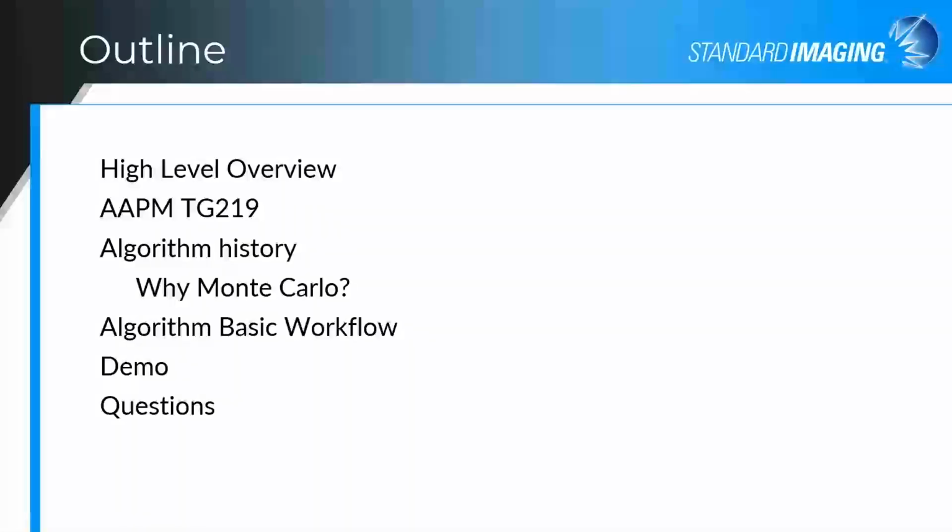So here's an outline of my presentation. I'll give a high-level overview of the product, then I will bring up a few topics from Task Group 219, step quickly through some algorithm history leading to why Monte Carlo, go through some quick algorithm basic workflow, give a brief demo.